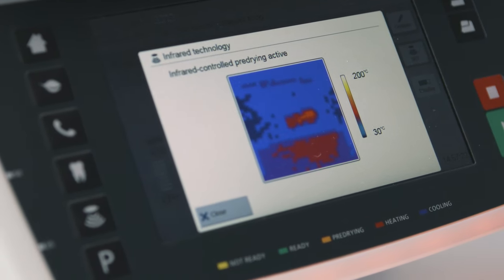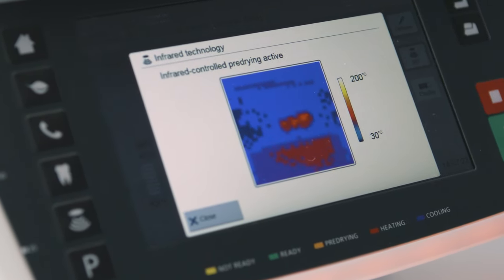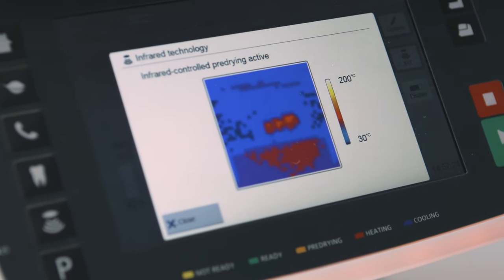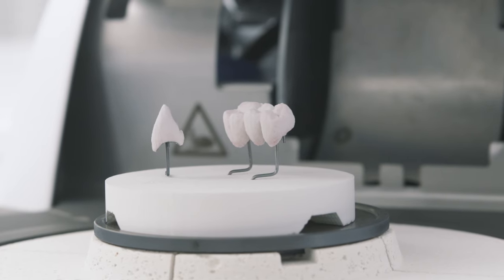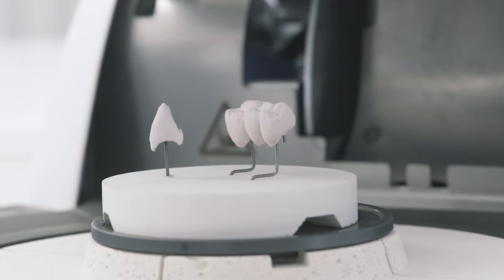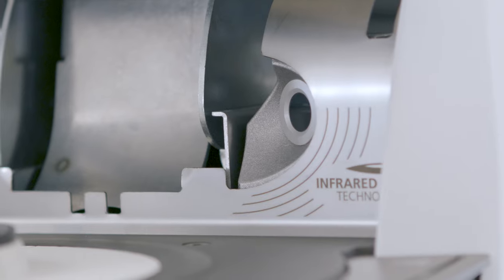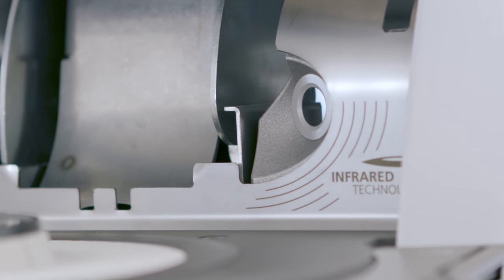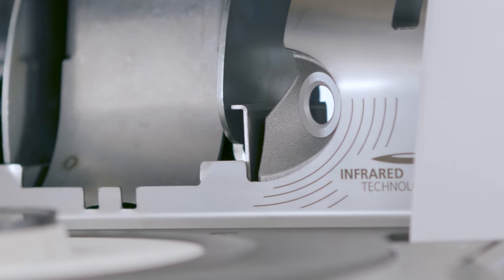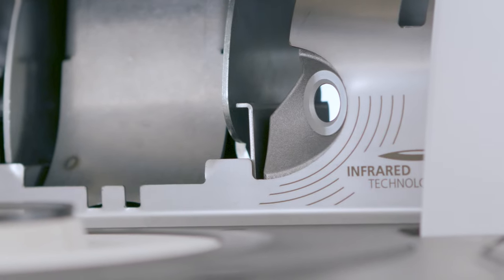The software uses the data it receives from the sensor to determine the optimal pre-drying and closing parameters, independent of the size and number of restorations placed in the firing chamber. The sensor also uses the temperature data measured on the object being fired to determine when the drying process is complete and the firing process can begin.